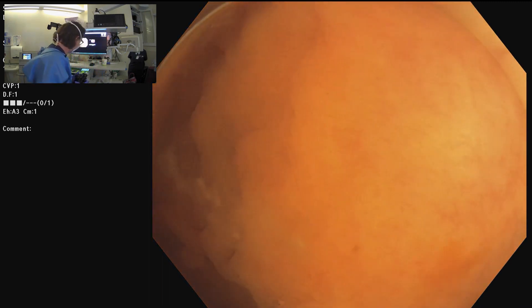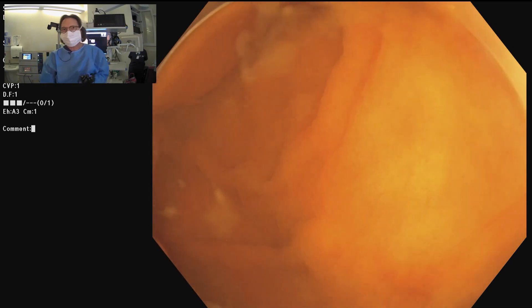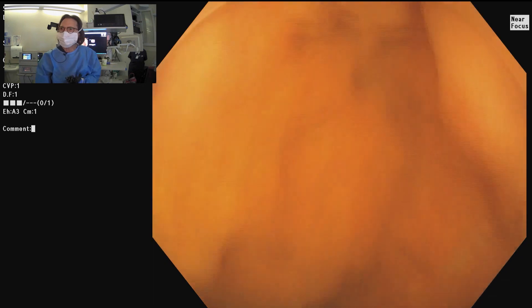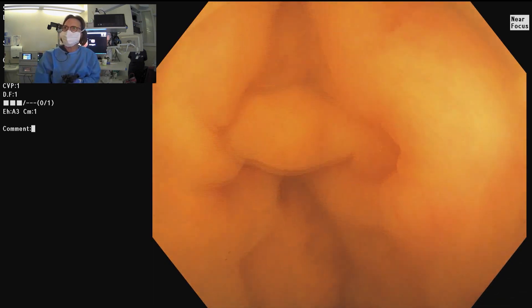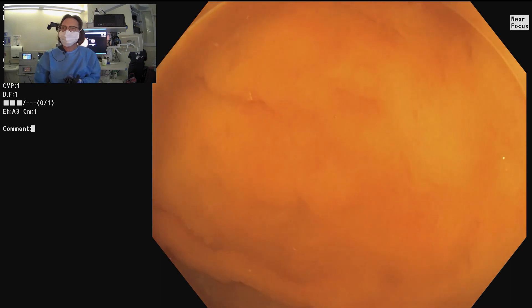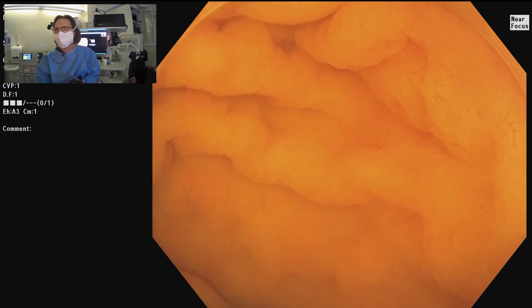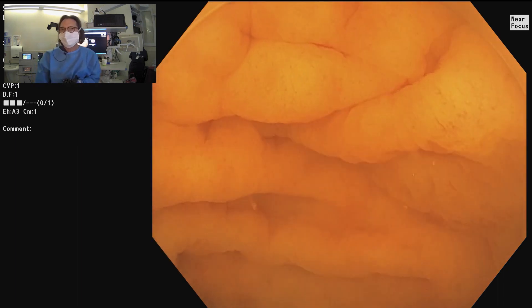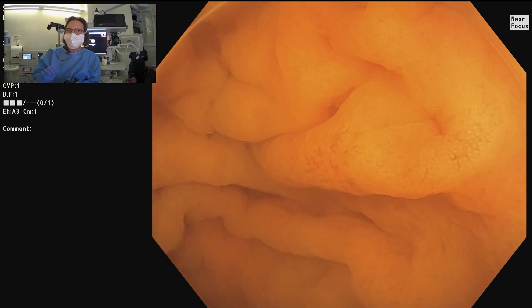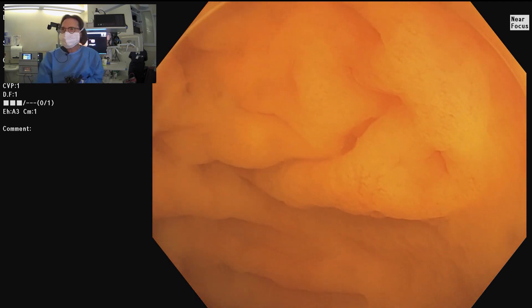I have a cap, and that's not so visible because of the zoom effect we get — the poor man's magnification with the underwater view. With near focus on, you can see how nicely we see the mucosal architecture and vascular patterns. This patient has an SSA, and the underwater technique is particularly useful for detecting SSAs for two reasons: first, you get that floating effect, so these very flat SSAs become more prominent and visible; second, you can really see that mucous cap well. If you see any mucus left after cleaning the lumen, you have to think about an SSA.